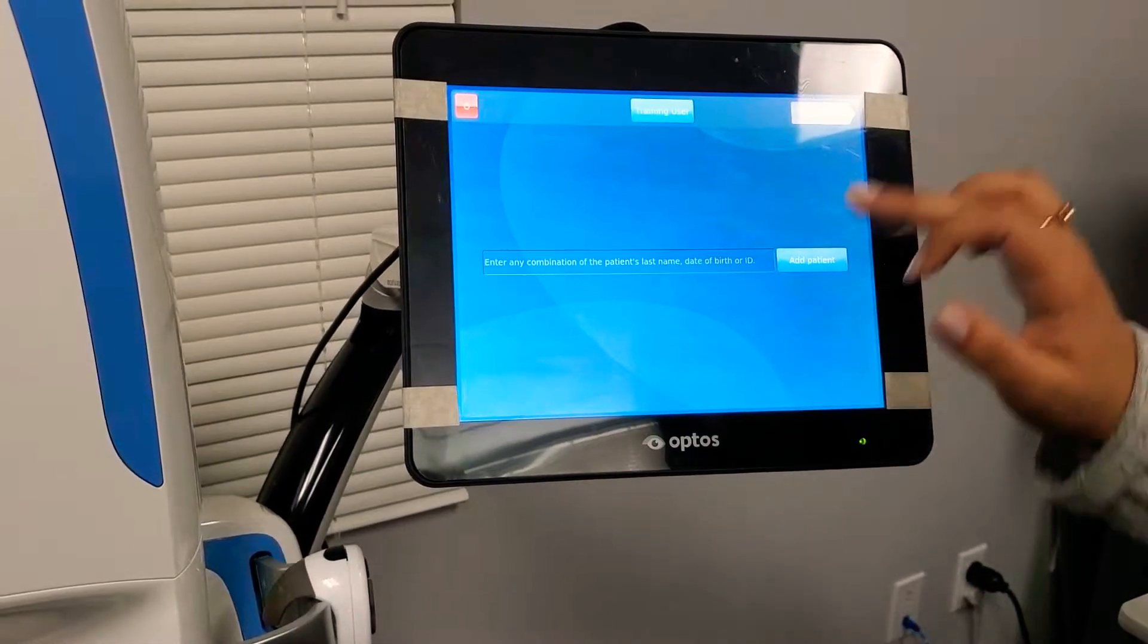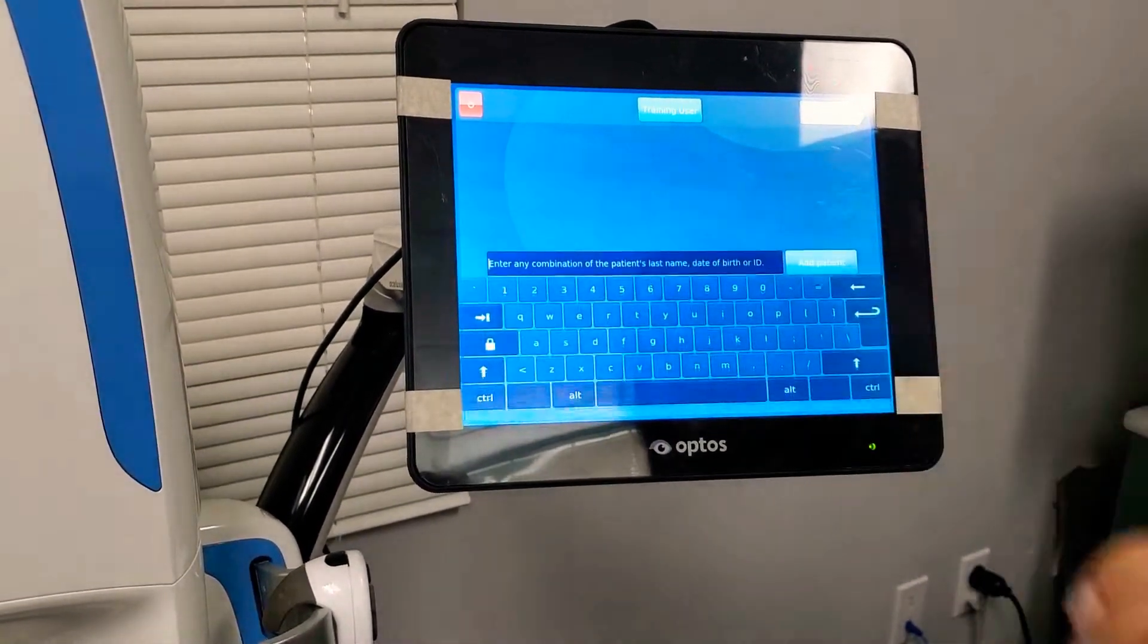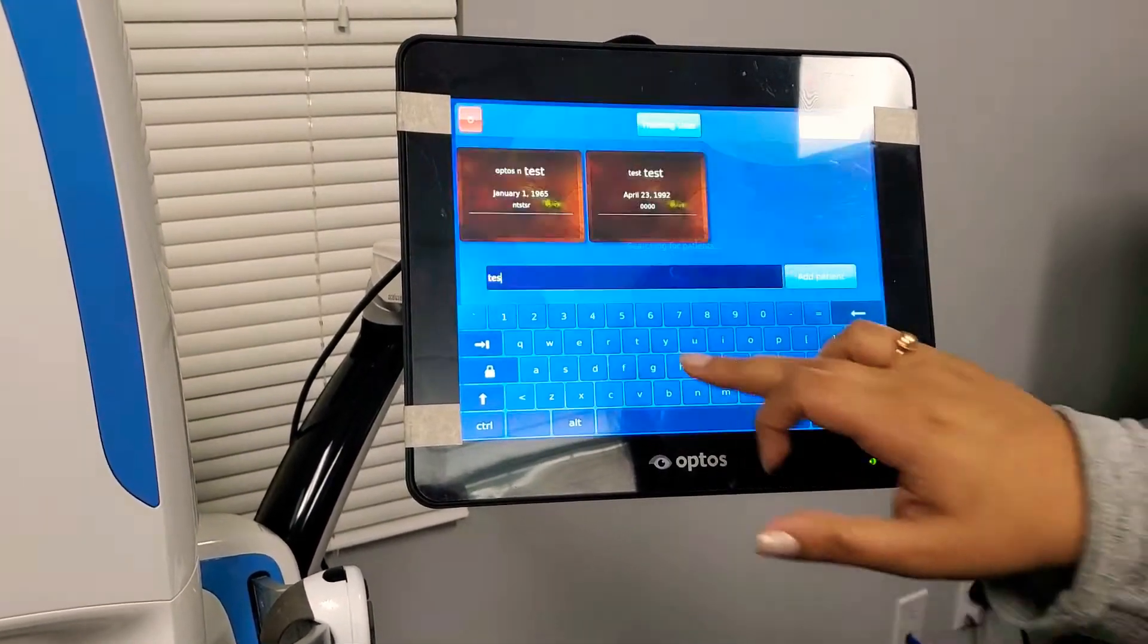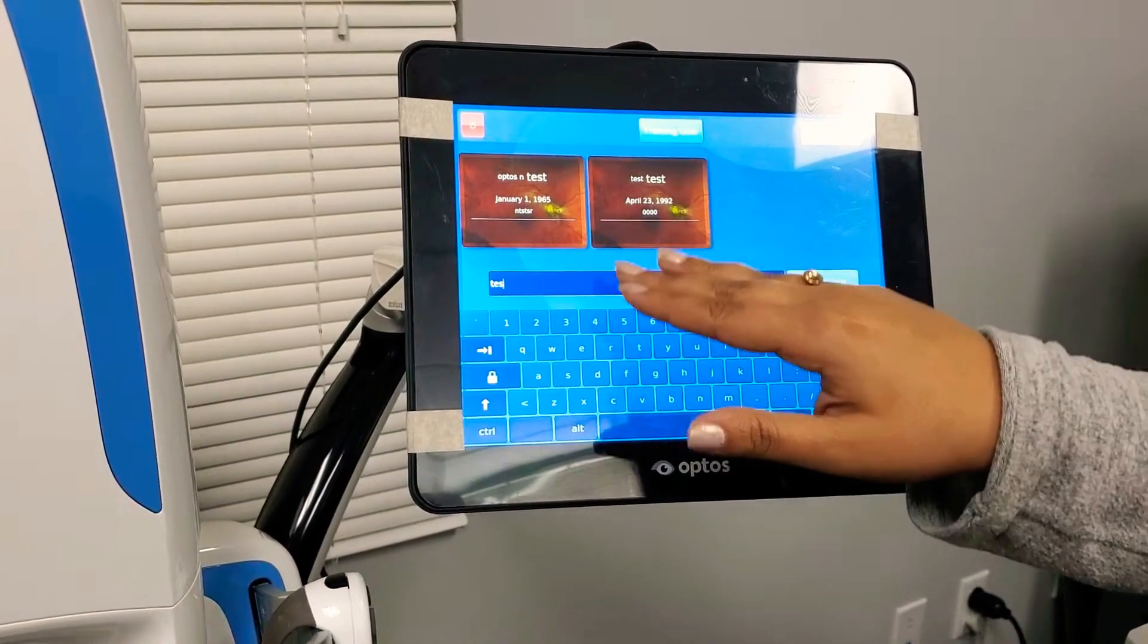To begin starting Optos, we go ahead and add the patient to generate a patient who's already been here. You just begin to type their name. So I'm doing tests and it generates anybody who's test.